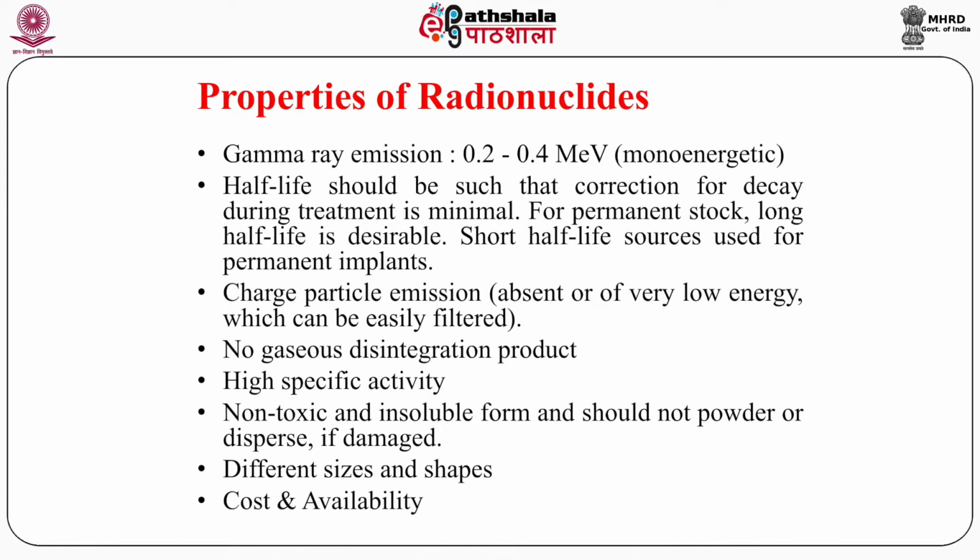High specific activity. The radioactive substance which is used should have high specific activity, meaning a small quantity of the material should deliver high radiation doses.